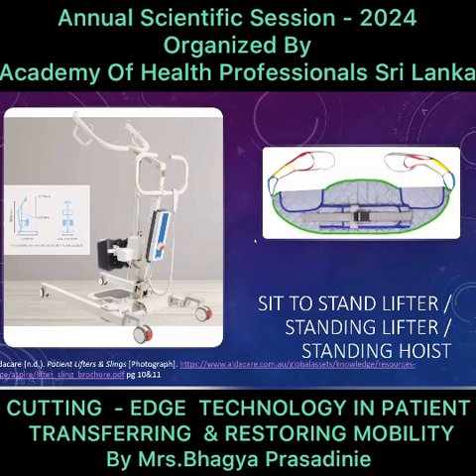Usually, if they don't have the trunk control and the leg control, we use the ceiling hoist. That is most suitable for clients or patients with maximal assistance and moderate assistance. For the people who are having moderate to minimal assistance, we use the standing hoists.